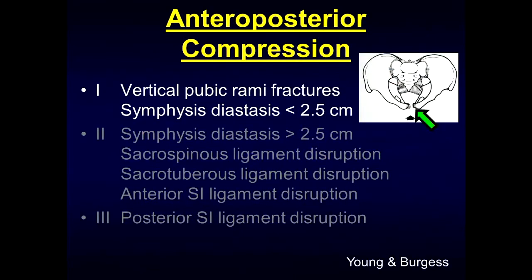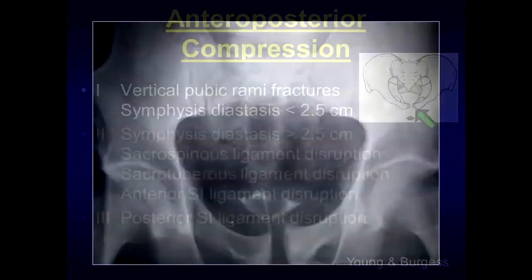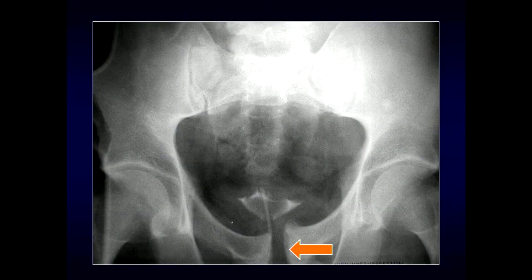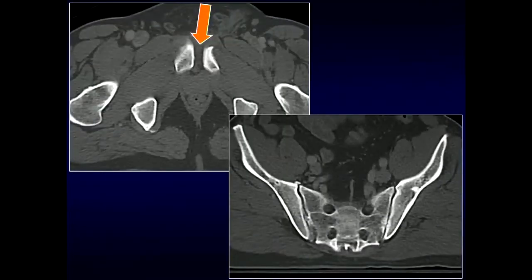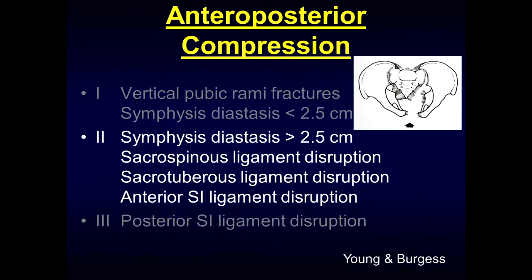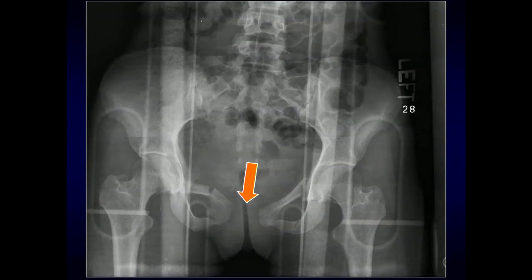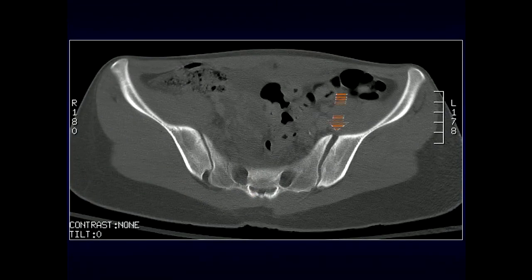In AP compression type 1, you can see the widening at the pubic symphysis on radiograph, and CT confirms that widening. In type 2, the symphysis pubis diastasis is greater than 2.5 centimeters, with injuries also to the sacrospinous ligament, sacrotuberous ligament, and anterior SI joint ligament disruption. Here we can see bilateral pubic rami fractures and widening of the pubic symphysis, with CT showing widening of the anterior aspect of the sacroiliac joint.